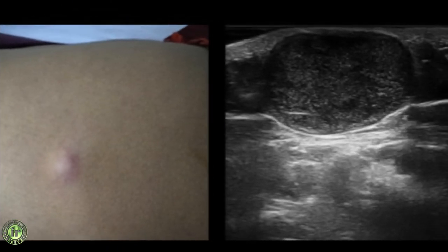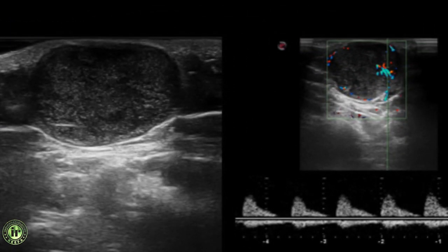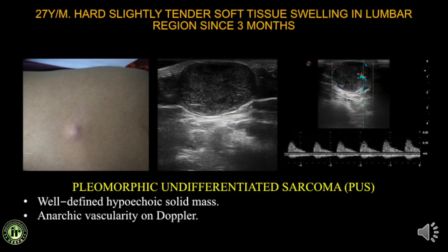A 27-year-old presented with a hard, slightly tender soft tissue swelling over the lumbar region. The swelling was well defined and located in the subcutaneous plane — one might attempt to call it benign. However, Doppler showed chaotic, anarchic vascularity — not a smooth pattern. It was therefore classified as an indeterminate lesion with concern for malignancy. The patient underwent FNAC followed by wide local excision, and histopathology confirmed a pleomorphic undifferentiated sarcoma. Always pay attention to the vascularity of the lesion.